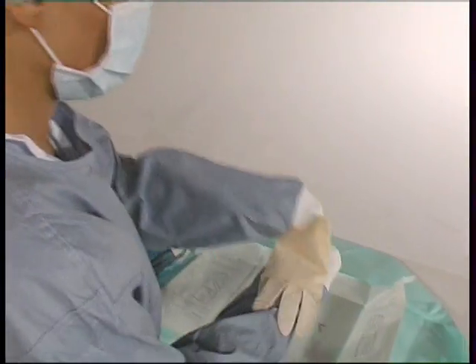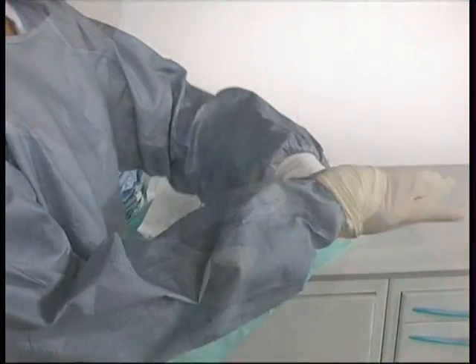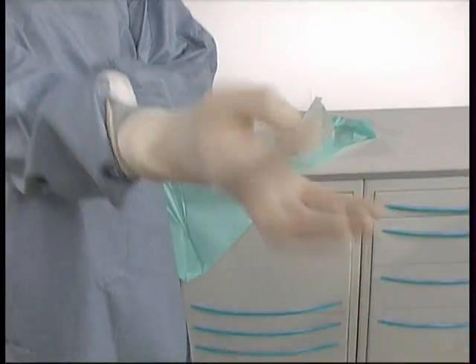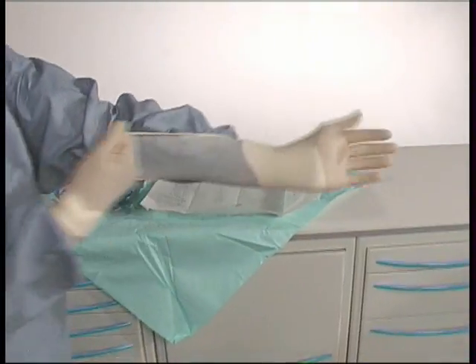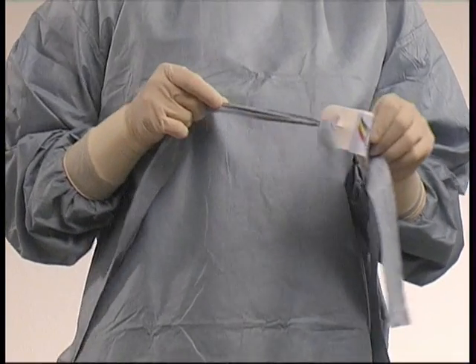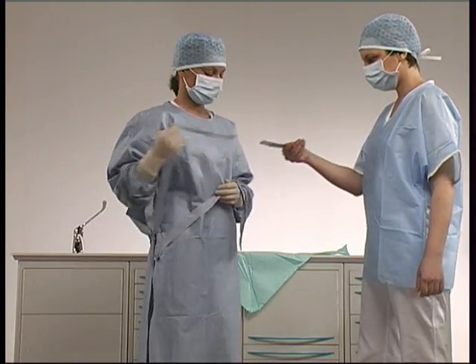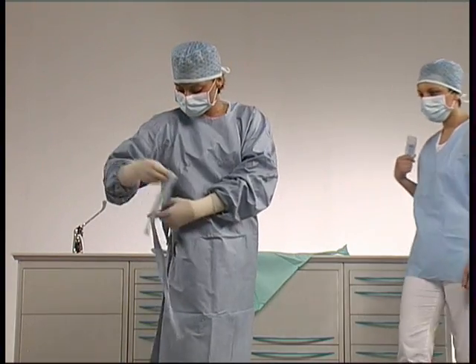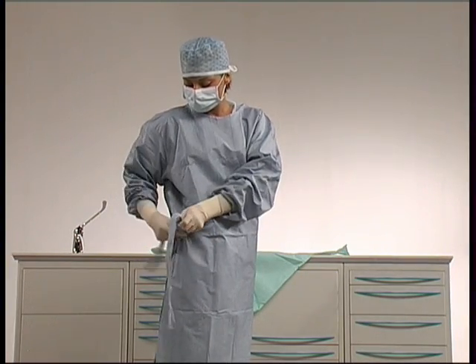Having taken the gloves from their wrapper, the assistant puts them on by herself. Specific techniques prevent accidental contamination. Then, with the help of the non-sterile assistant, she fixes the gown with the external ties. From this point on, the assistant is considered sterile and must not touch any non-sterile object.